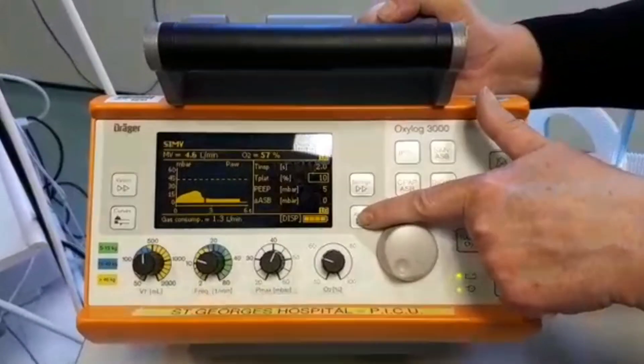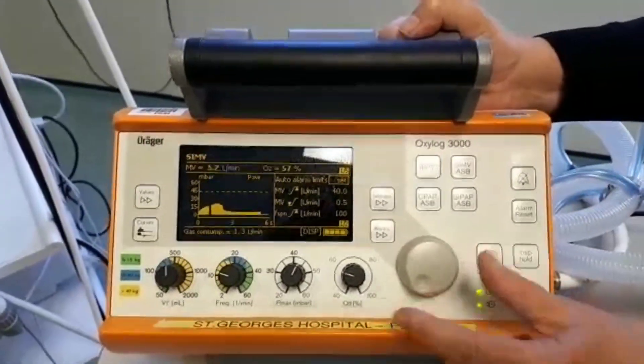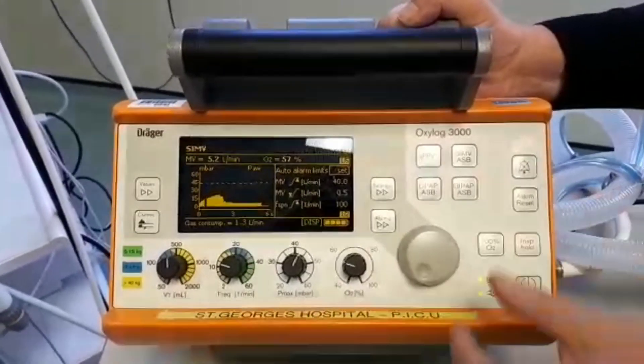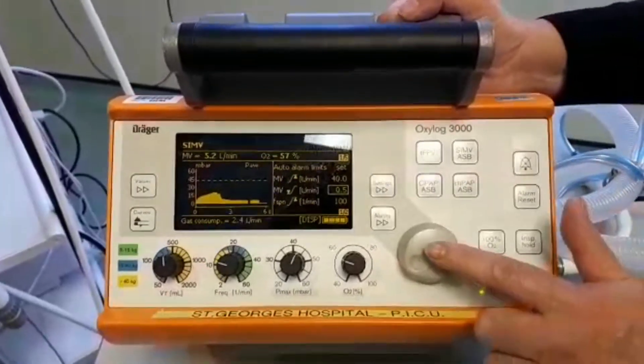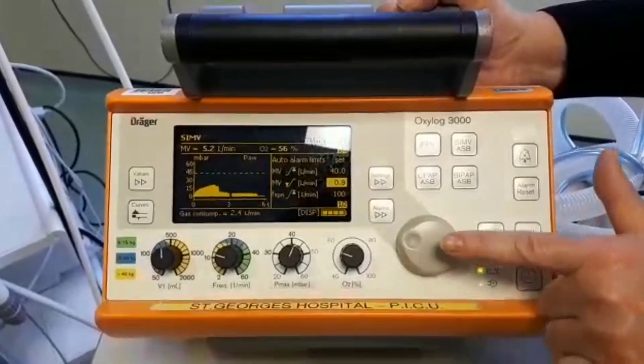We set our alarms using the alarm key. Again, exactly the same as settings, we have more than one page. You press the alarms to access the pages, use the control knob to highlight the parameter you wish to change, press to confirm to enter, change, and press to confirm.